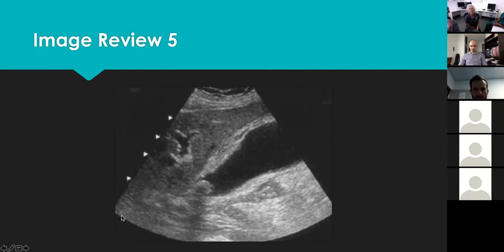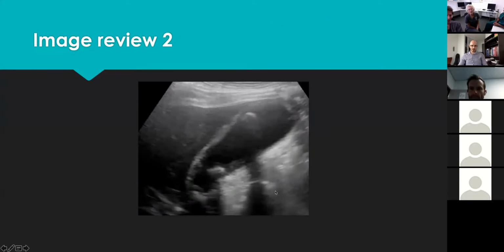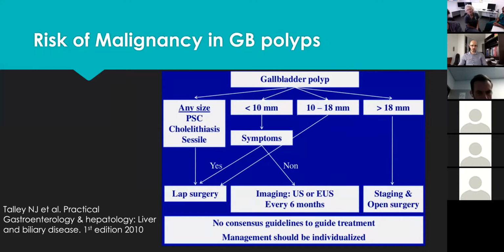Perfect. Now, just to make sure, because this issue of clean shadow and dirty shadow can be a bit confusing. If you look at, for example, this dirty shadow of the gas, you can see it's actually a bit more hyperecho in comparison to the surrounding area. Or let me just go back a little bit further.